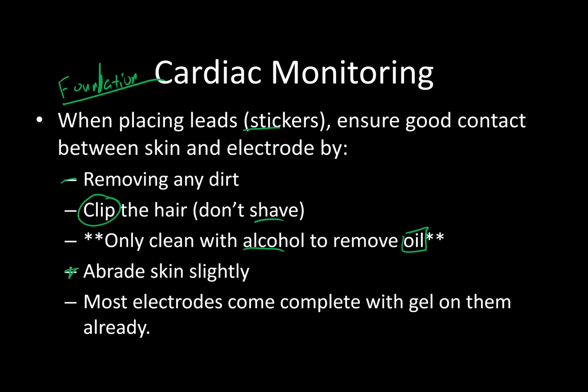If you have one of those individuals that has really dry, flaky skin, some older folks tend to have a little bit of that layer built up, you may want to actually abrade the skin slightly. A lot of modern telemetry patches actually have a little strip on the back side of the sticker, like an emery board. That's what it's for. You're supposed to gently sand off the skin, for lack of a better phrase, wipe that clean, and then put the sticker on. It'll greatly improve your connection, improve your signal, cut down on artifact, and just make life overall easier.